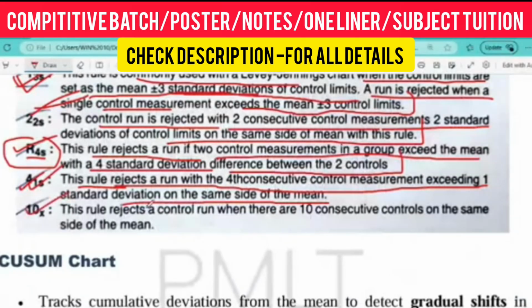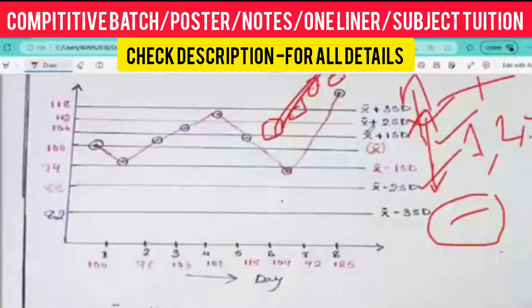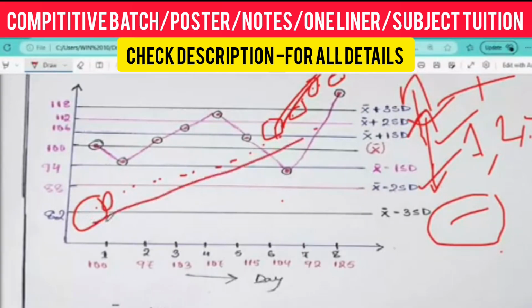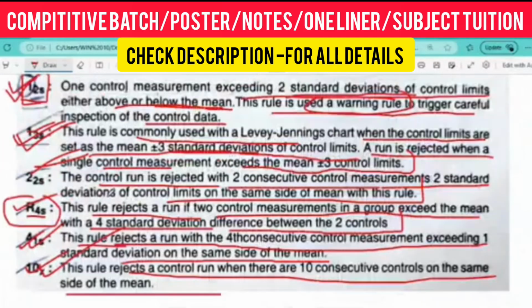And 10x: the rule rejects the run when 10 consecutive values fall on the same side of the mean. Whenever it exceeds 1s or 2s or 3s, repeated in 10 consecutive runs, 1 2 3 4 5 6 7 8 9 10, it is also rejected. We cannot take the result. That is called 10x. These are all the Westgard rules.